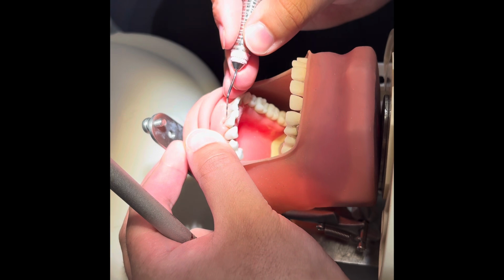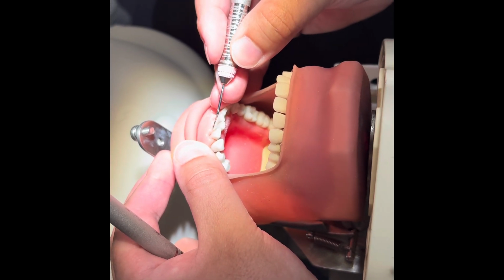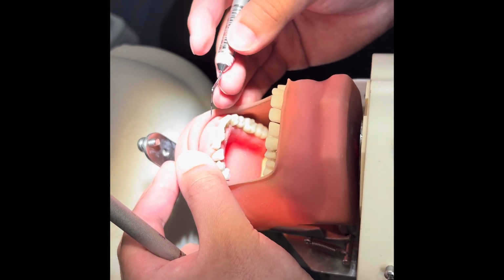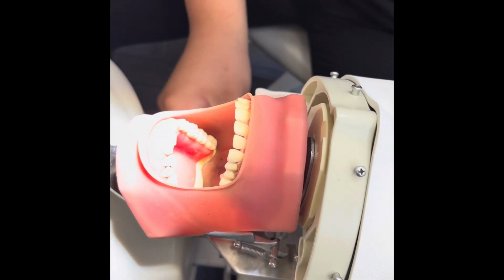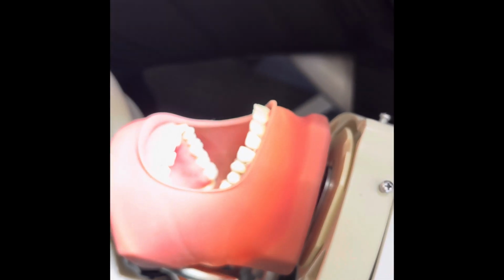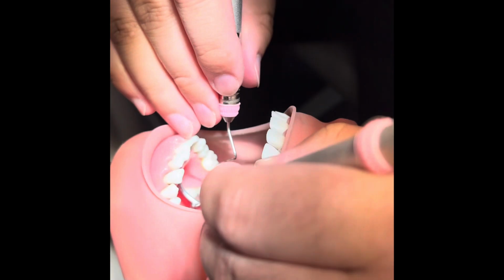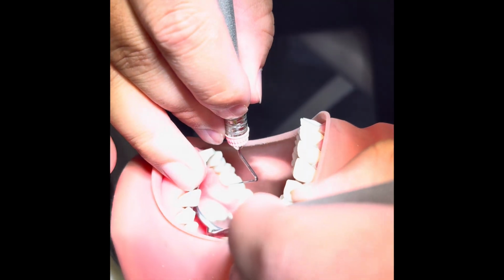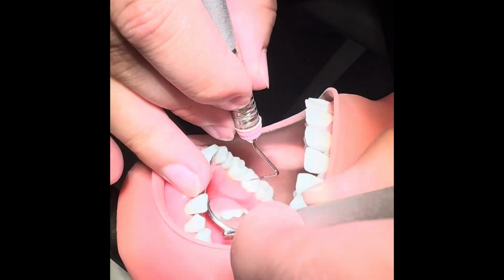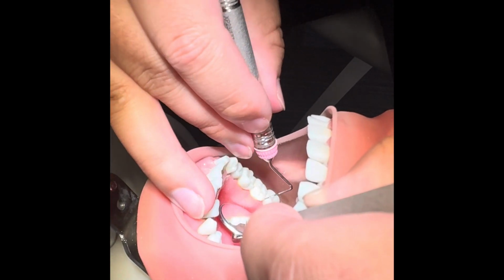And here we're moving to the lower on number 24 facial. And then here we're moving towards the lingual of number 30. Just making sure we keep the pen grasp, keep that fulcrum nice, and using the mirror to retract the tongue.